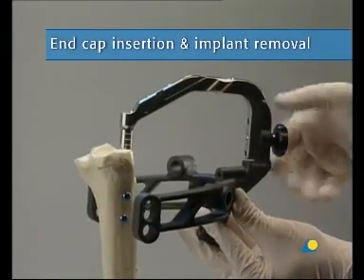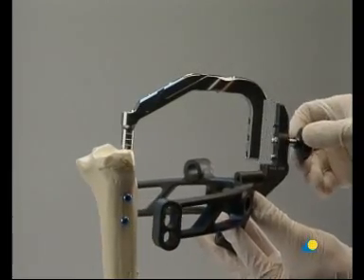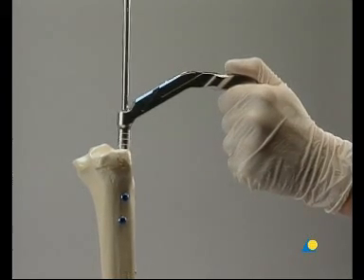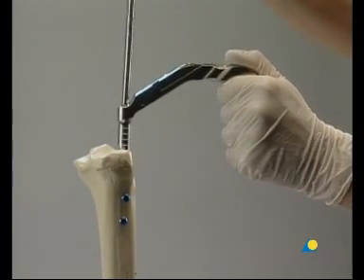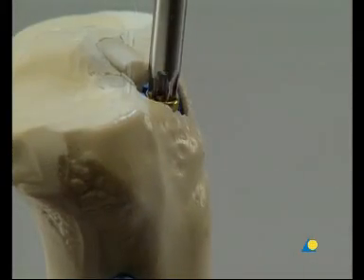The end cap prevents bone ingrowth into the proximal end of the nail, making nail removal easier. The patient's leg should be positioned in flexion to assure that there is enough space to insert the end cap. The aiming arm, the connecting screw, and the insertion handle are removed. The end cap is inserted into the nail with the screwdriver and firmly tightened.